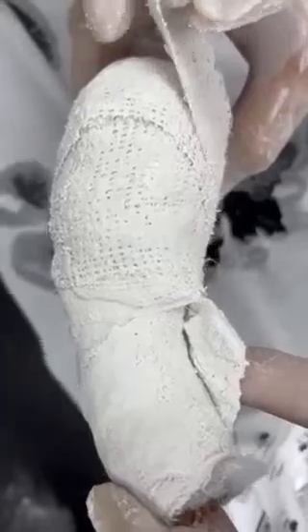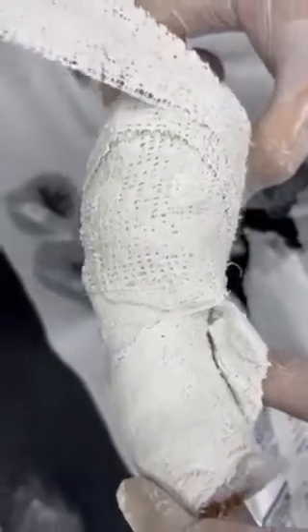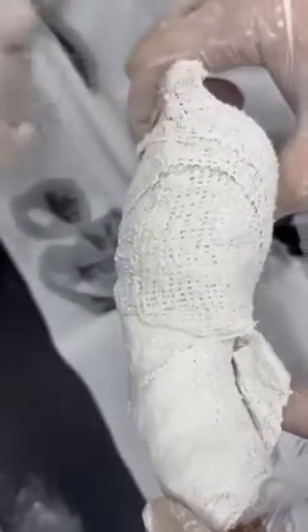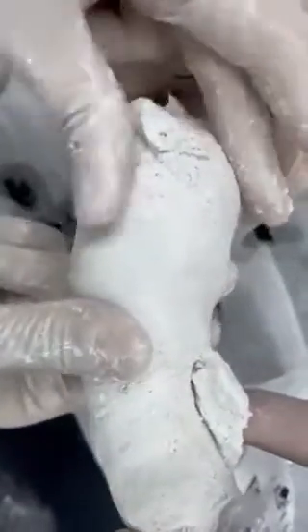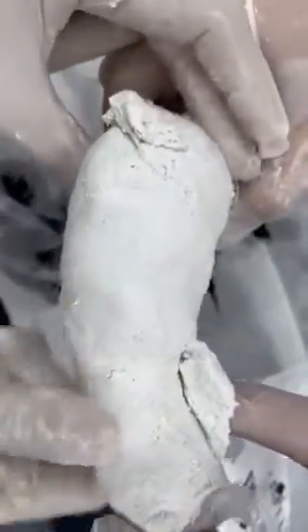And the same, I will leave for the family this knob of cast material to have it for the next time, just to mark where they can unwrap the cast material. And now we're done.